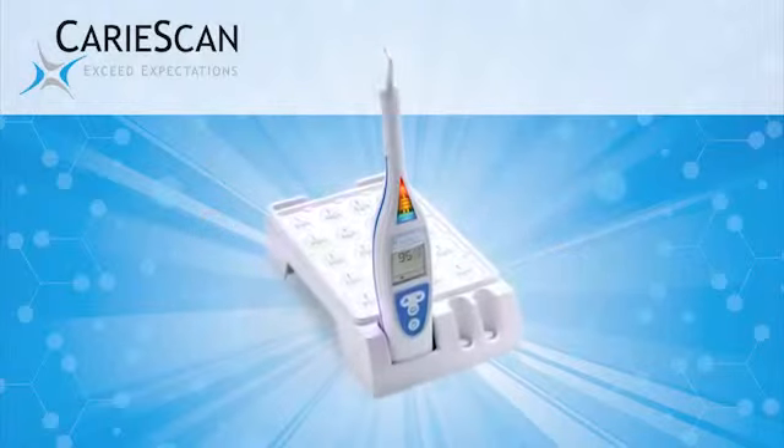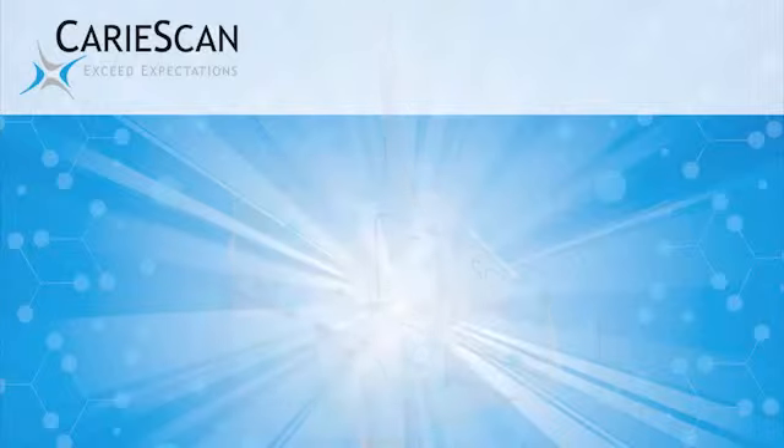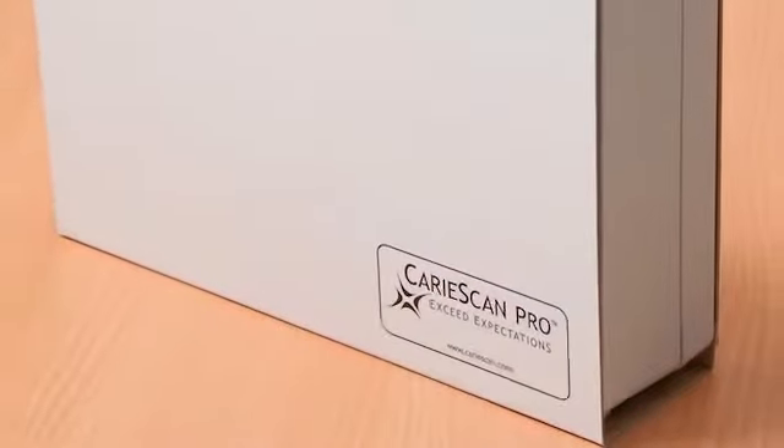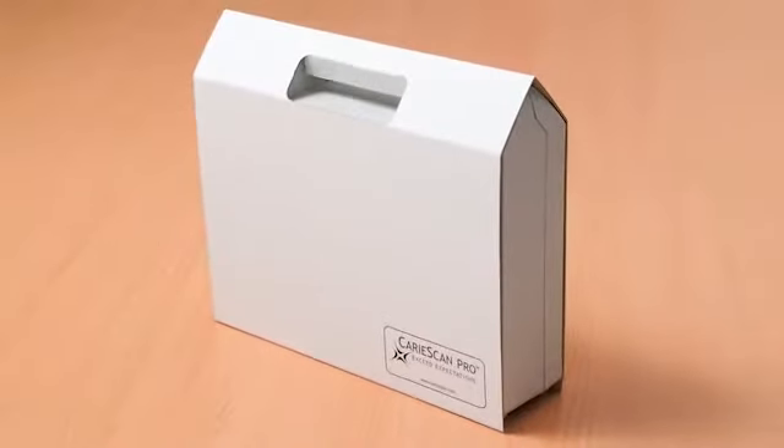Congratulations on your recent purchase of CarieScan PRO, the most advanced technology for accurate and confident caries detection. In no time, we'll have you powered up and ready to scan your first tooth. So let's get started.